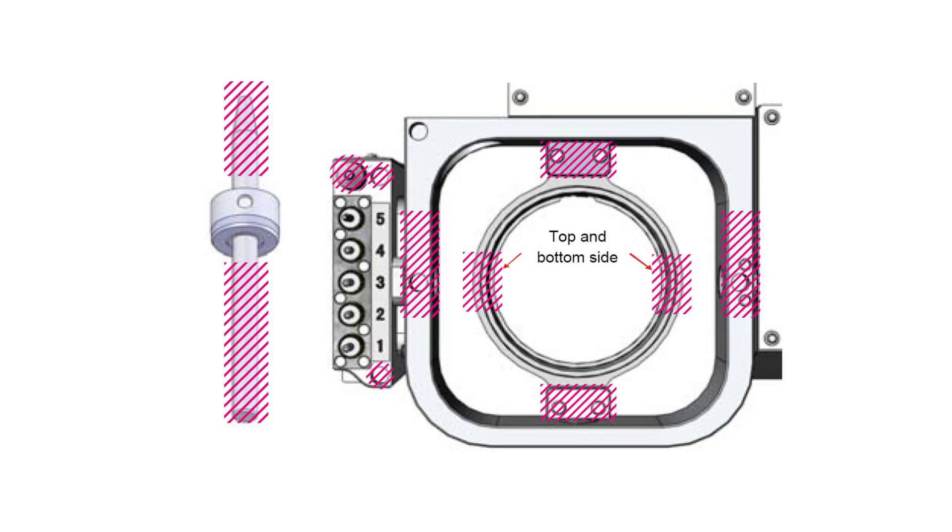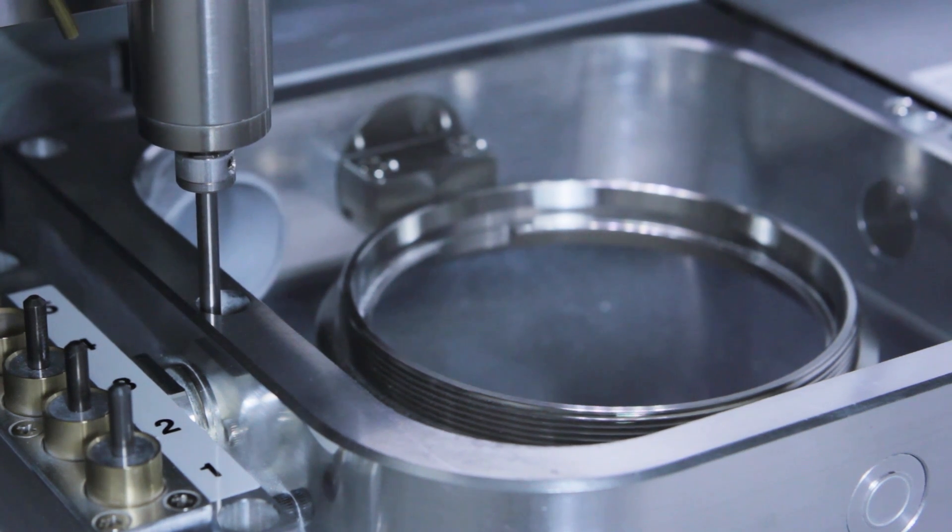When performing the periodic correction, the outside edges of the ring fixture, the pockets of the rotary and ATC, the tool sensor, and the calibration pin are the most important areas to clean. These will be the areas that are measured during calibration.